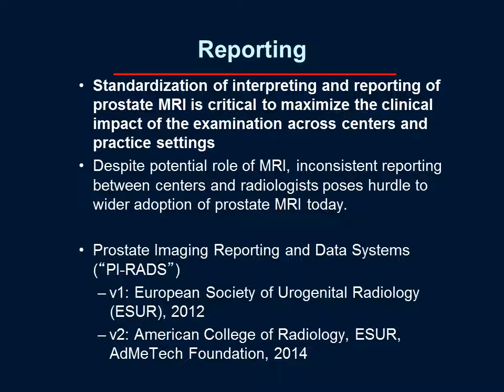We're getting at this with the Prostate Imaging Reporting and Data System, or PI-RADS. There was an initial version from the European Society of Urogenital Radiology in 2012. Version 2 was initially launched in December 2014. This was a joint effort of the American College of Radiology, ESUR, and the AdMeTech Foundation.